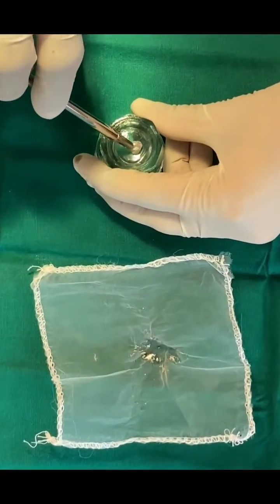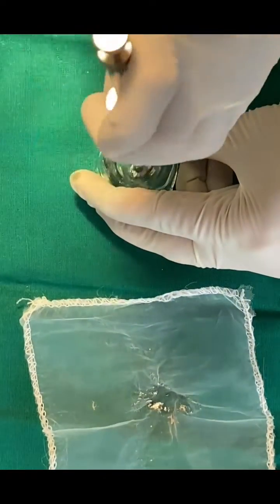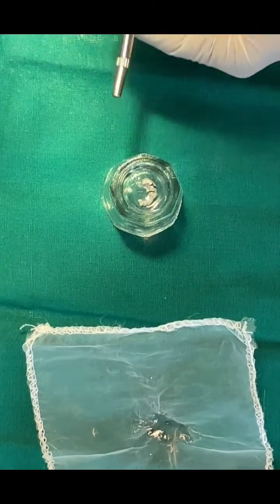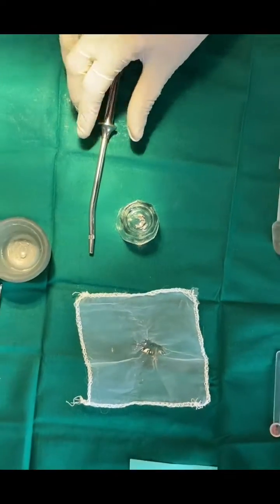Now carry the mix with an amalgam carrier to the prepared cavity.